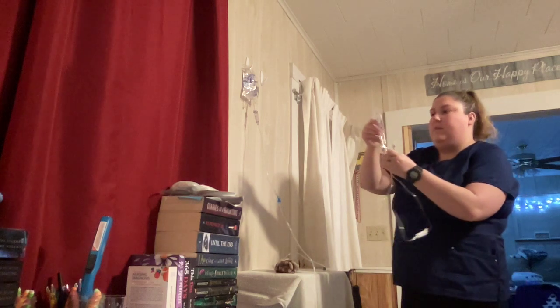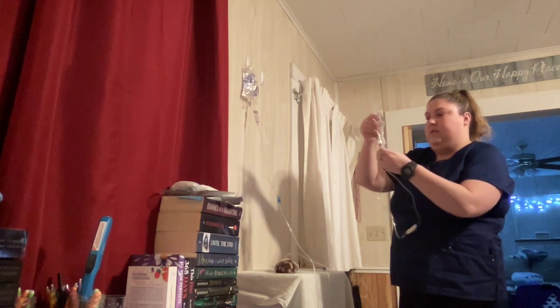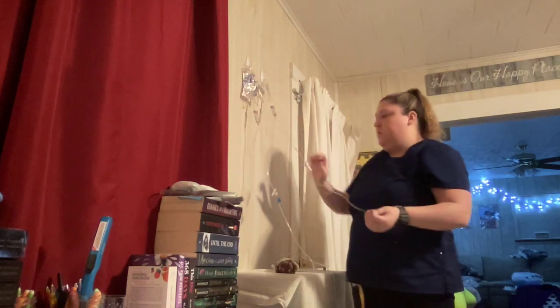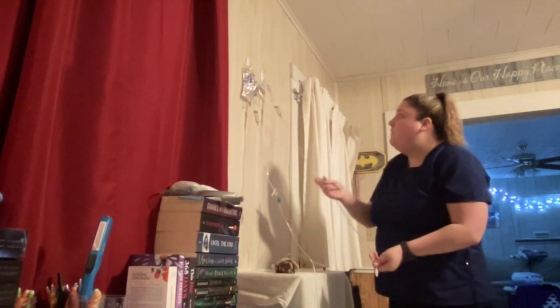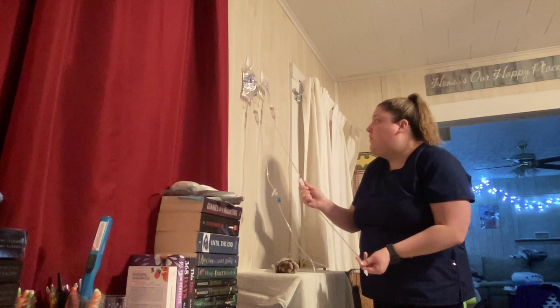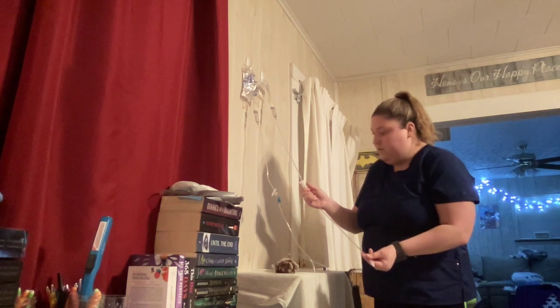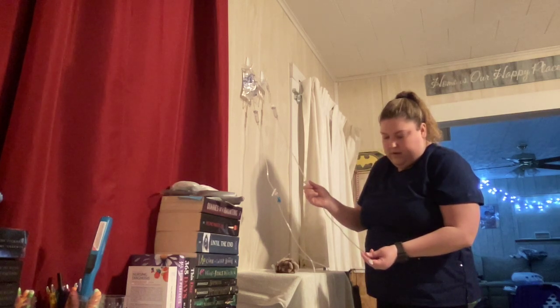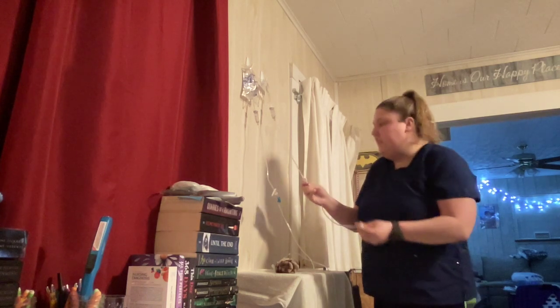Fill my chamber here about halfway. And I'm going to do this very slow as not to waste any of my medicine. And I don't want any bubbles in my tube or anything like that.